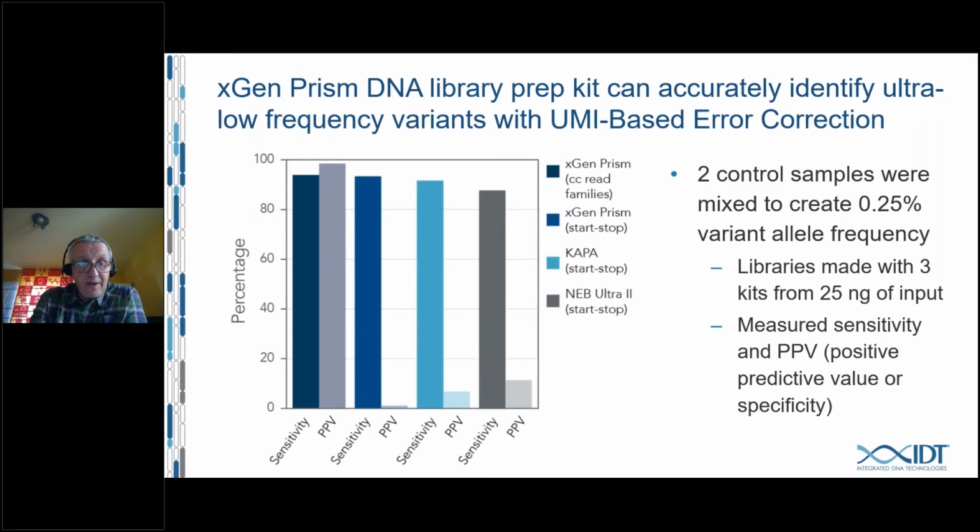Looking at the variants that have been called, we are looking here at sensitivity. So it's the fraction of mutations that we expect to find, and which fraction do we really find in the data analysis. This is for the three technologies quite high, around 90% or above.